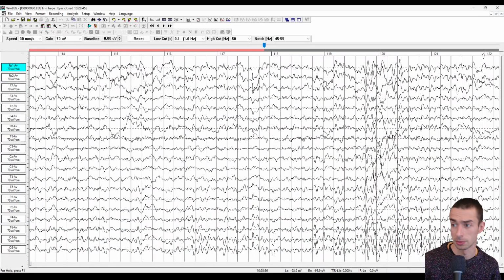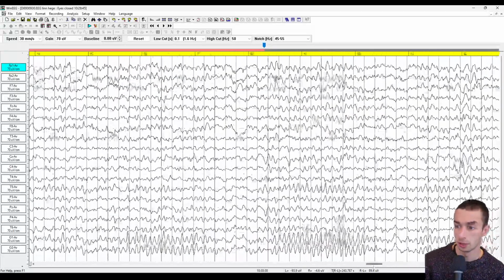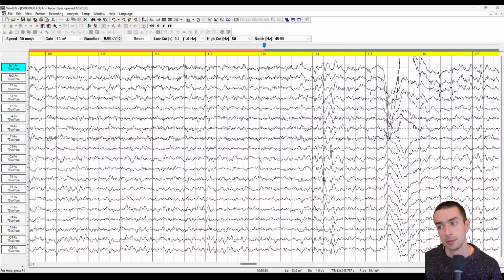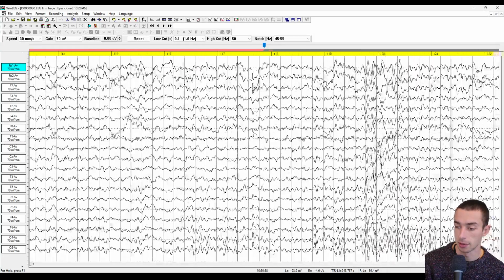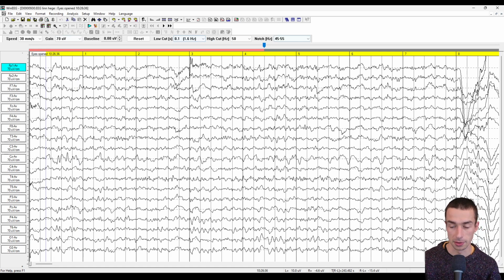I already showed how you do the filters and the montage, but my favorite feature of winEEG is the ICA artifact correction. And I'll do a longer video on this, and just so you know what I'm doing, I right-clicked at the end of the file in order to create a selection, and I'm going to left-click at the beginning. That's how you make selections of data in winEEG. You left-click on the left bounds and right-click on the right bounds.